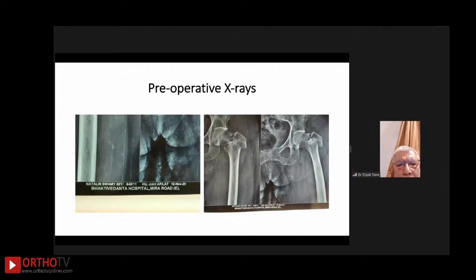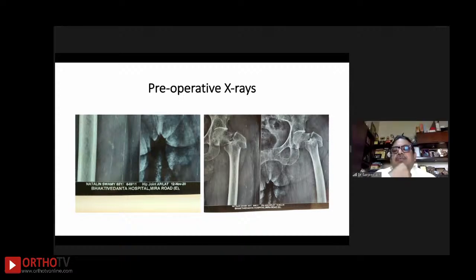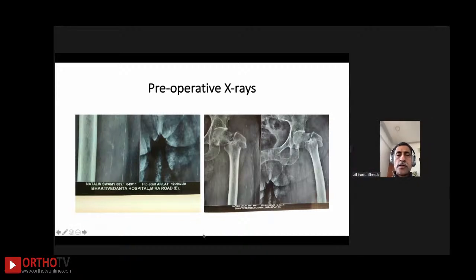So Harish, Dr. Sanjeev, if this would not have been hemiplegia, would you have done dual mobility? Well, she is only a 68 year old person, and normally primary prosthetic replacement for an intertrochanteric fracture is done only if the patient is very elderly with life expectancy not more than 10 years. So these are people who are 78, 80, 82 years old with severe osteoporosis. This patient seems to have very good quality bone. You can see the bone is not bad. So in that scenario, primary fixation would have been my first choice had there been no hemiparesis.